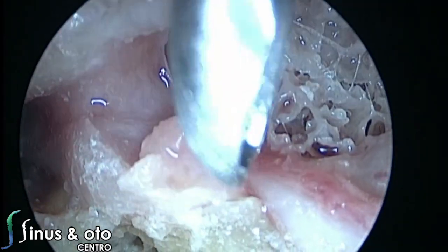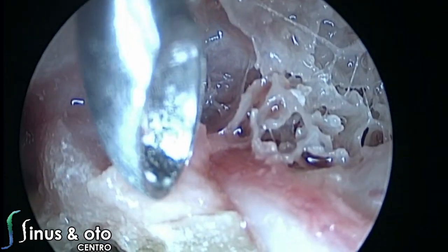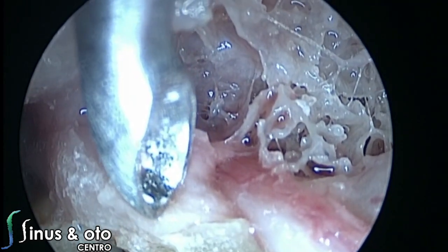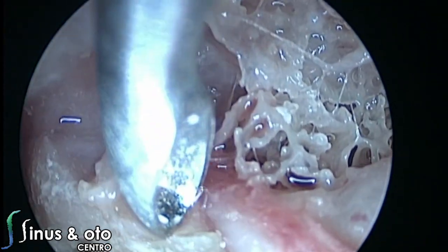This is a very important relationship. They are very tied together, the tensor tympani muscle and the geniculate ganglion, which is a little bit more anterior when compared to the cochleariform process.